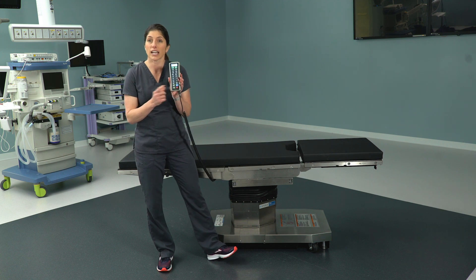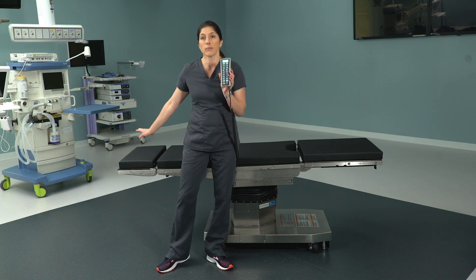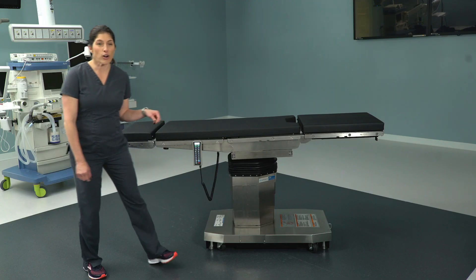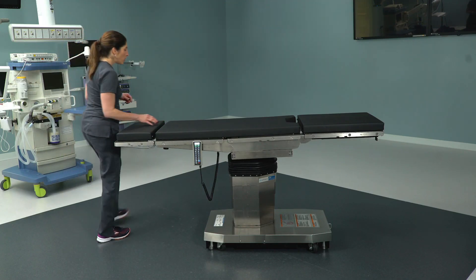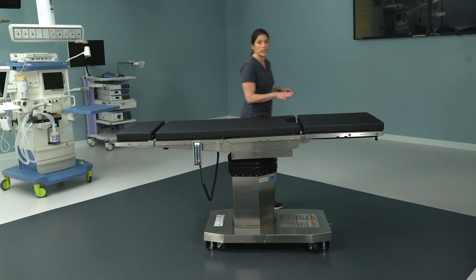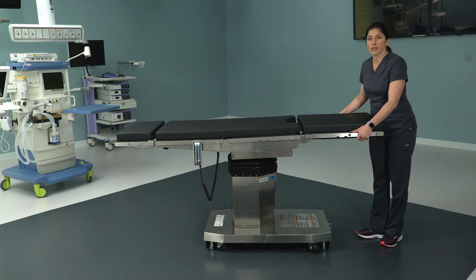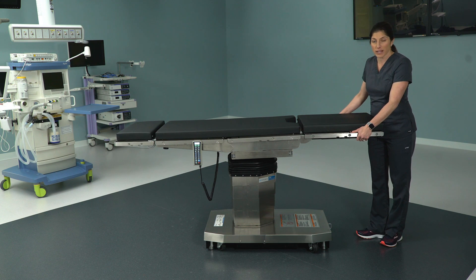Otherwise, this should always be green, indicating you're in normal orientation and the patient's head goes at the normal end of the bed. Another major difference between the 3085 and the 5085 is the leg section — rather than just lowering it down, you now have the ability to remove the leg section. In fact, this is the featherweight leg section, so it only weighs 14 pounds.